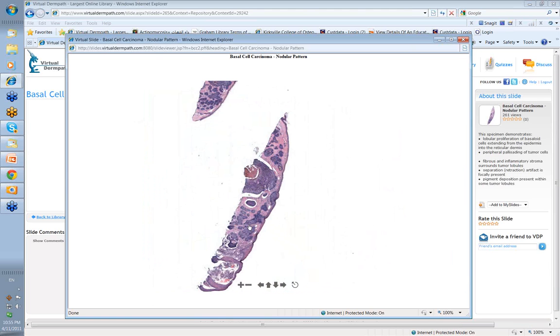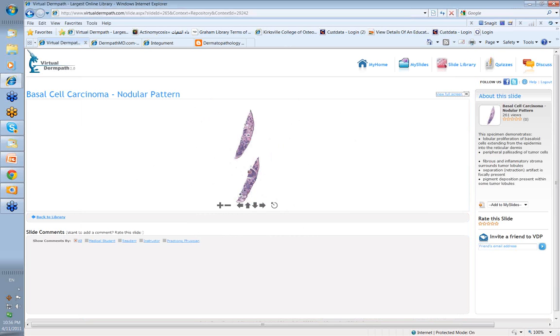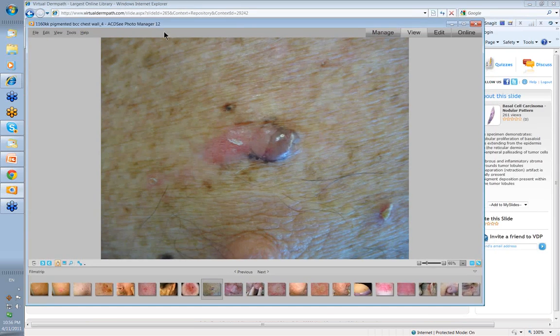If that was pigmented, then these groups of cells with a dermatoscope would appear as blue clods. Let's just see if we've got an example of that we can bring over. Okay, here's a BCC that's made up of a mixture of different parts. There's a cystic component here. You can see some blue pigment associated here. You can see a pinker portion of the BCC with the superficial vessels.